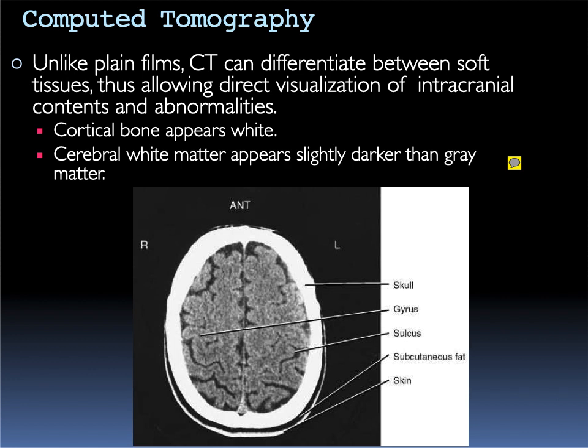Cerebral white matter appears slightly darker than gray matter.